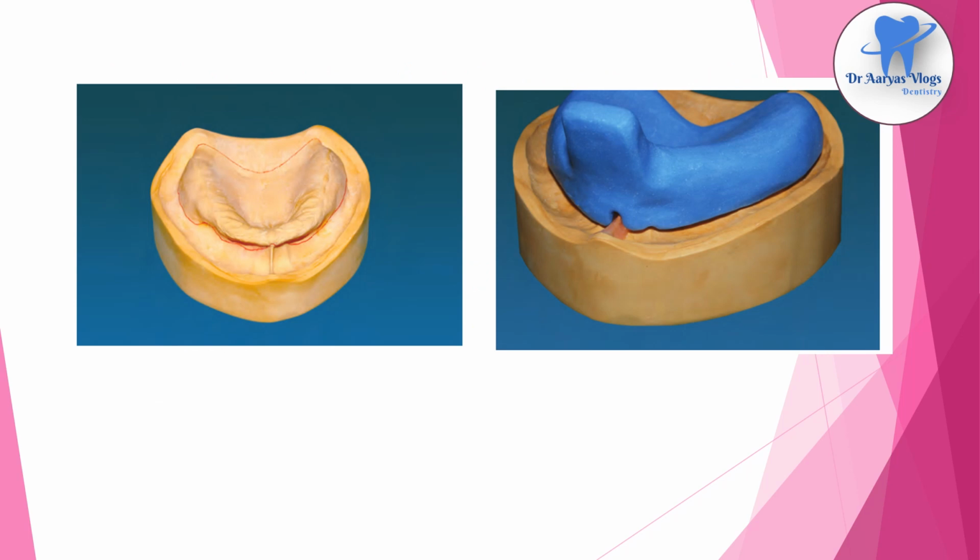Here this is the maxillary diagnostic cast with the tray outline marked. Now notice that this is the high frenulum attachment and also tissue attachment. The outline indicating the border of the tray is several millimeters above the depth of the vestibule in the anterior area. Noted the high frenal attachment. Here this is the custom tray which is fabricated with the labial and buccal borders approximately 2 mm above the depth of the vestibule. The posterior extent of the tray is the vibrating line.